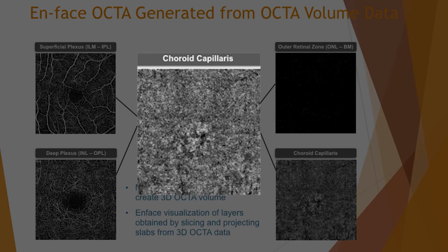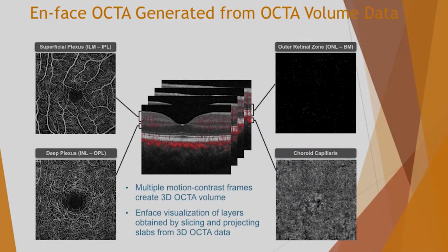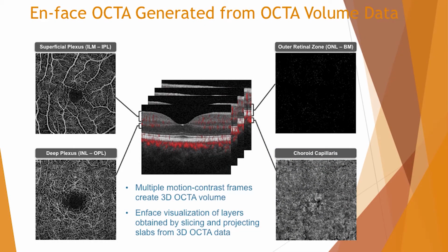So this we have posted in our clinic at Nova, so the students can always remember what normal looks like. Because again, if you don't remember this slide, Nate's presentation especially, because I think Rob's doing glaucoma, but it will make no sense to you. You have to remember normal to understand what abnormal looks like.